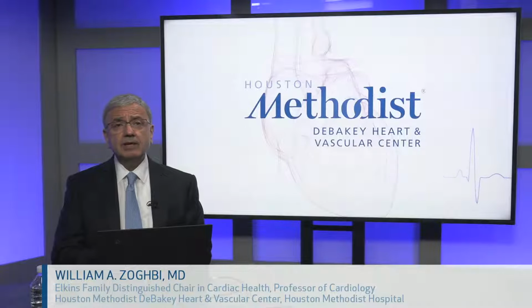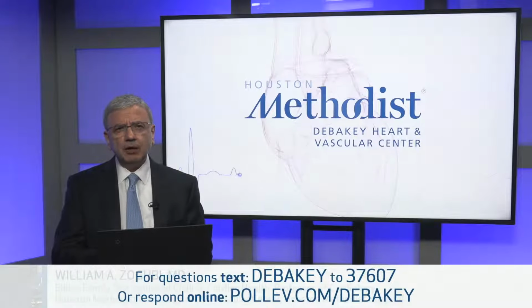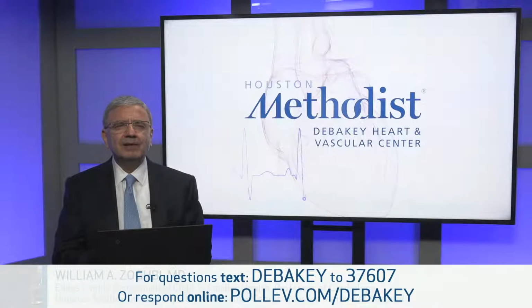And you could say to yourself, my goodness, I've used contrast already. I can look at wall motion. I could look at global function at the same time, right? Why not use it? And yes, you can. The question is, what is the added benefit? Because perfusion and wall motion are closely coupled. Yes, the perfusion may be a little bit more sensitive, but they're closely coupled. So if the advantage is there, it may be outweighed by the variability that you're going to see. So keep it in mind. You could add it, but I'm not sure about the overall benefit.